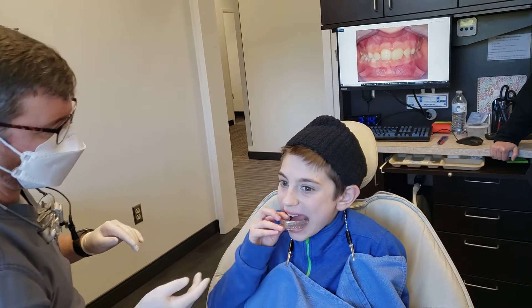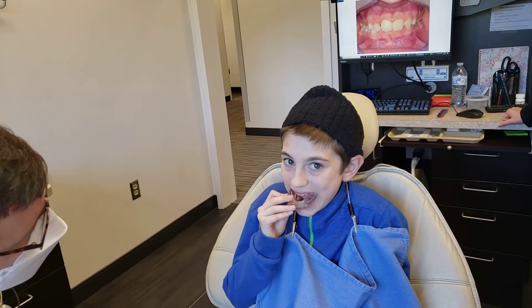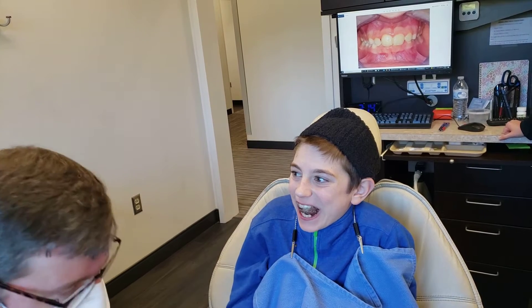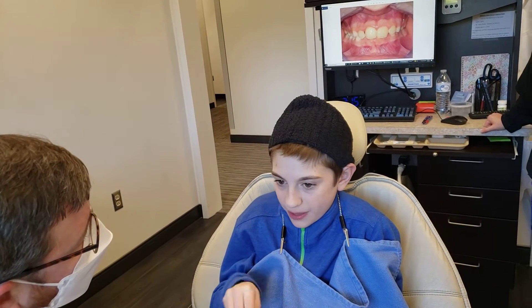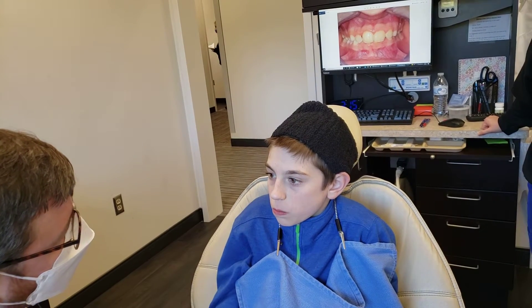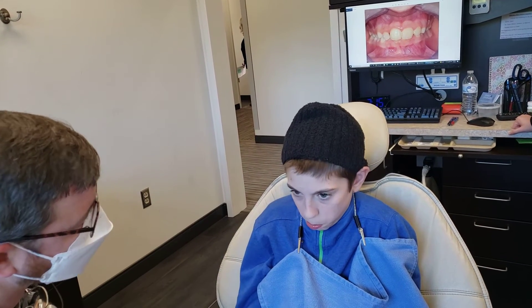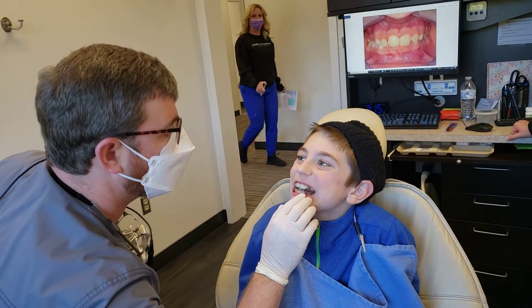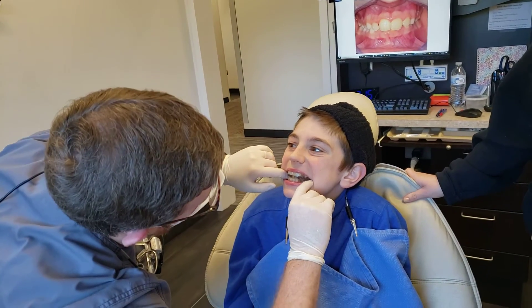Let me see how you put this one in. TT2, all right, perfect — you put it in right in the middle. Okay, now close your teeth together. It still hurts? I want you to push hard enough where your teeth are in there but not so hard that it hurts.